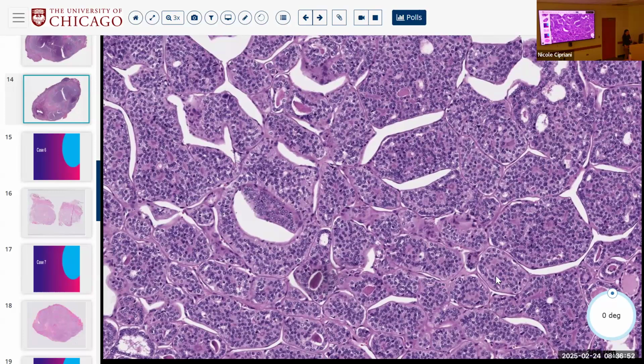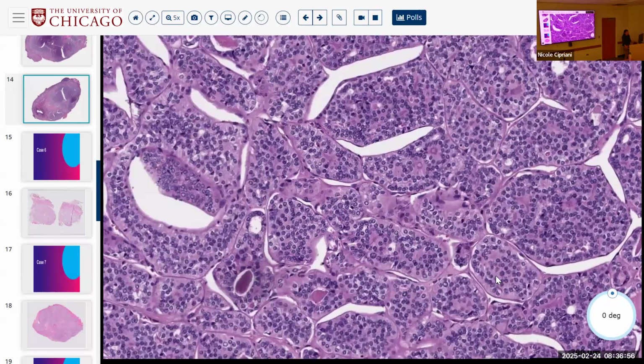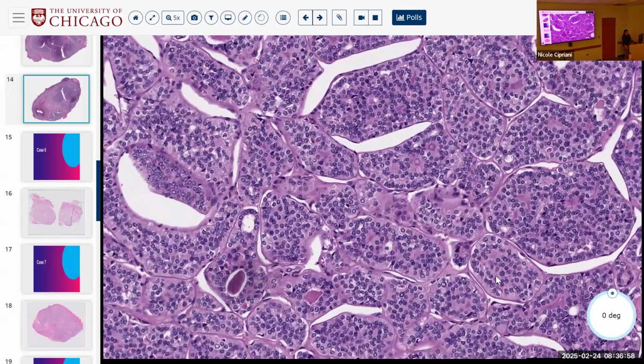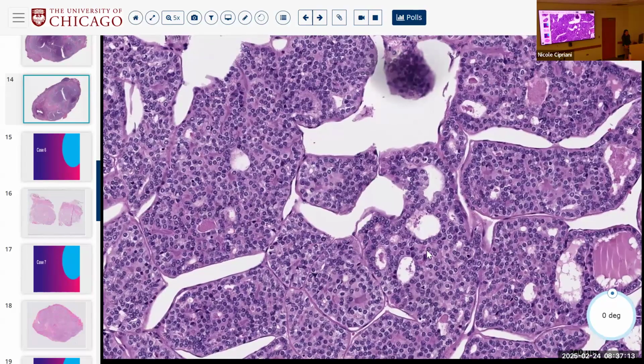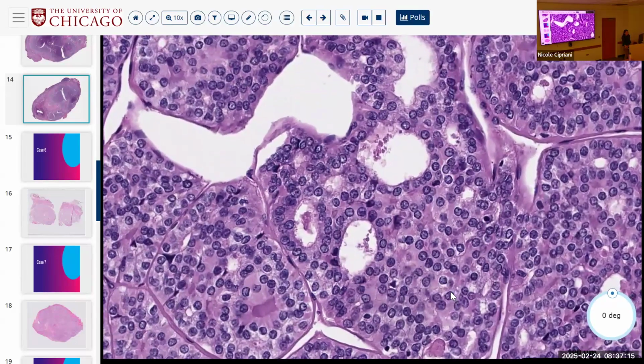Up here, papillary. But you mentioned that the nuclei aren't so bad, right? Yeah, I thought psammoma bodies were pretty specific. So when you see this morphology where you have a highly infiltrative tumor, you have psammomatous calcifications, but your nuclei aren't super PTC-like.